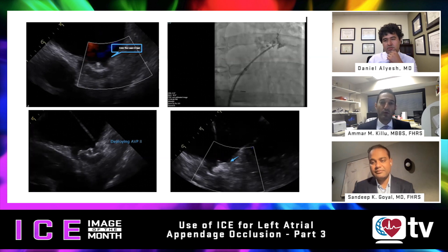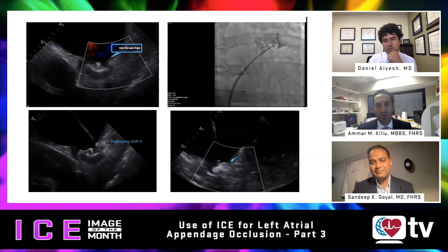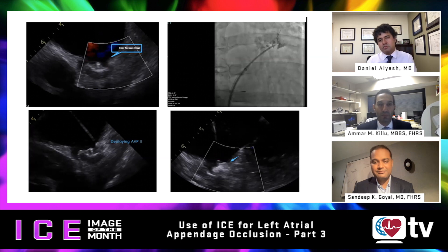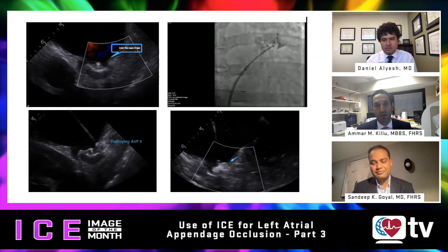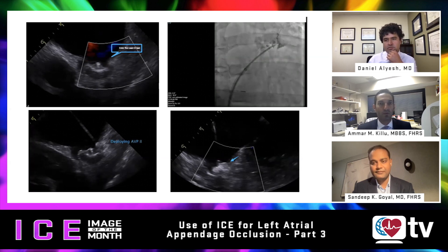I think they work well together hand in hand. There have been one or two cases where we absolutely could not use contrast and performed it with zero contrast, so fluoroscopy had a smaller role. But they complement one another — there are certain things you'll see on fluoroscopy that you can confirm or refute on ICE. Sometimes we see things on fluoroscopy we're concerned about, but then verify on ICE that there is adequate occlusion, good compression and stability of the device.